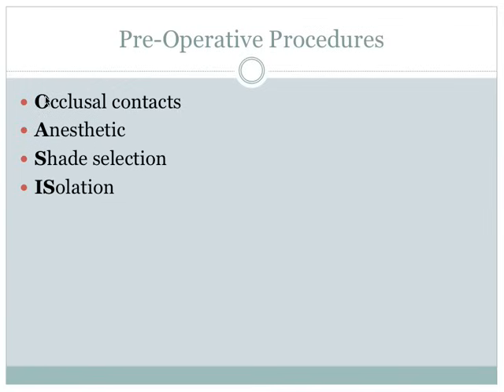After checking for occlusal contacts, you can deliver your anesthetic in the proper block or the proper local injection that you need to do. You can also check shade selection if you're doing a composite tooth-colored material.